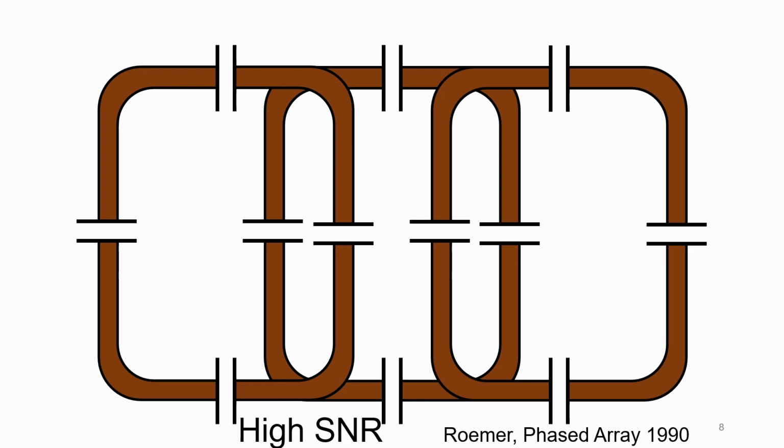And the magic of having multiple coils is now you can pick up signals from each of these coils and then recombine them to create an image with very good SNR. And this sort of paved the way for an important field, which is parallel imaging. See, as I mentioned earlier, MRI can take a long time, and a lot of the research has been put into making it faster.